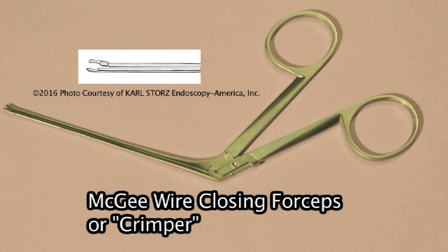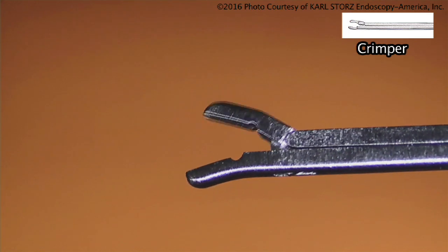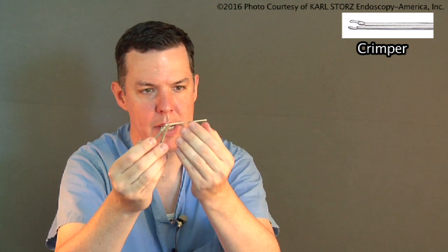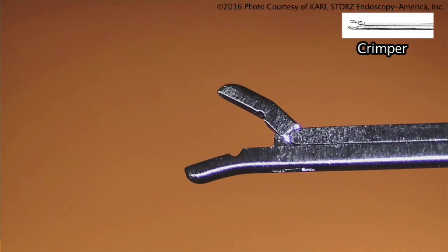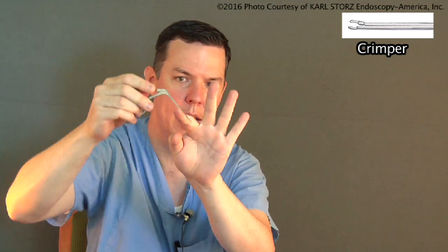One of the arts we may be losing a little is the art of crimping. A crimper is used to crimp a stapes prosthesis crook over the incus — that's its primary role. We still crimp prostheses because we can't always use laser-crimp prostheses. A crimper has a curve to it — it almost looks like a little alligator head tipped downward. It's placed over the crook and used to curve the prosthesis over the incus, rather than just pinching it.